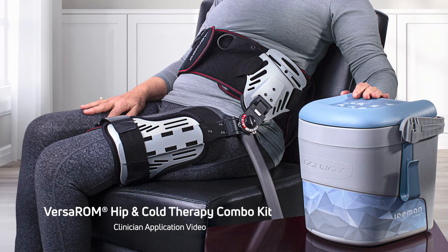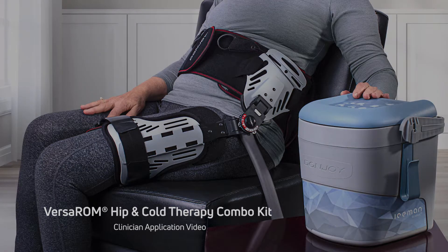This video will detail the application of the Donjoy VersaROM hip brace with the Classic 3 universal pad. For additional information, please refer to the instructions for use found in the packaging.